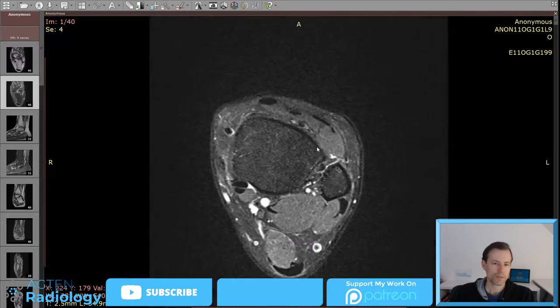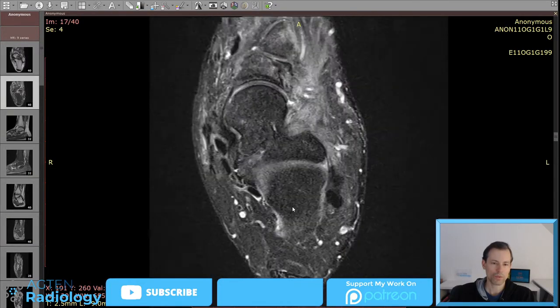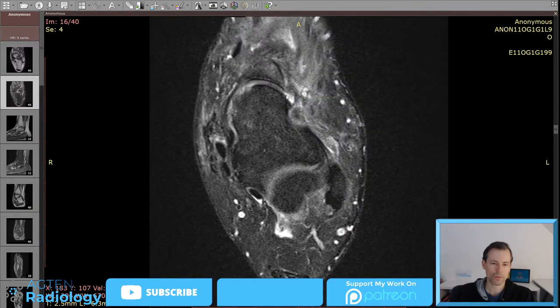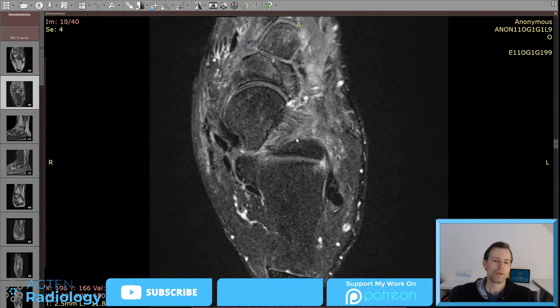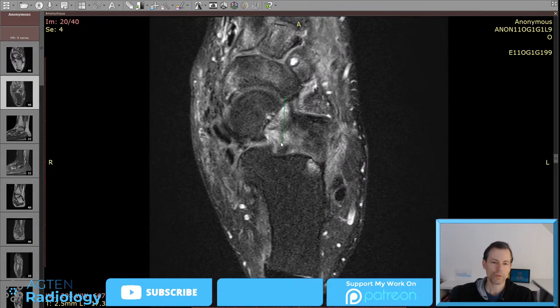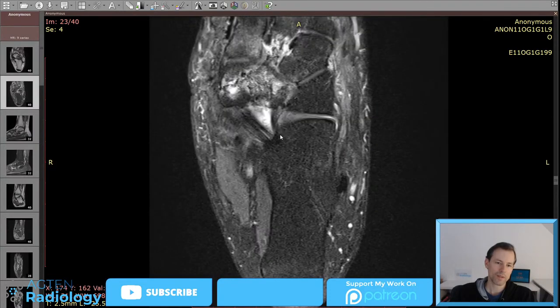And I think it's very easy to understand once you know how you can really appreciate these two ligaments. This is just a simple trick now. You scroll from proximal to distal. Then you check for the calcaneus. It's coming now here. So we see the calcaneus. Now, what you have to do, you have to look for the 90 degree angle of the anterior portion of the calcaneus. Well, it's maybe not the best example. It's not really 90 degrees. But at this notch or at this corner here, you can then see the plantar portions of the tibiospring ligament complex.